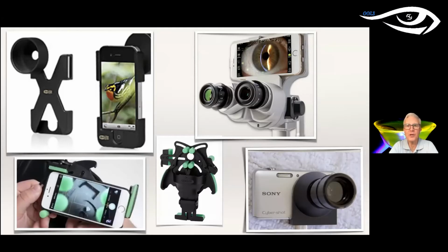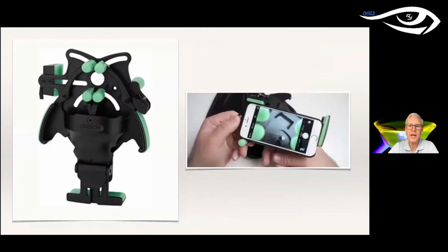On the bottom right, cellular phones have pretty much taken away the need for these little digital cameras, but they still work very well. And if you look at this picture down the bottom right, you can see that is an attachment to the little Sony or Casio camera, whatever you have. And that attachment slips into the ocular of the slit lamp itself. Now that works very, very well. And then on the upper right, we'll take a couple other pictures of that here in a second. That is a Nidek or Marco unit, depending on what is distributed in your country, and attaches to the slit lamp.